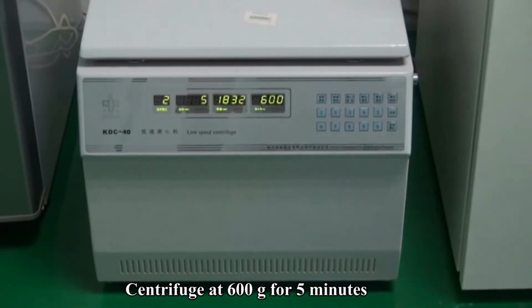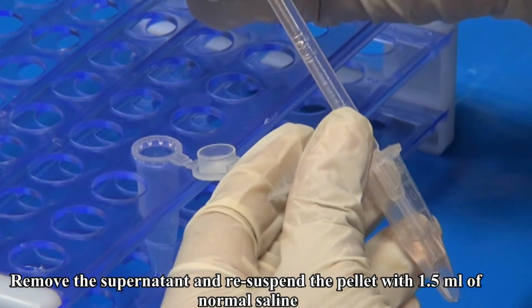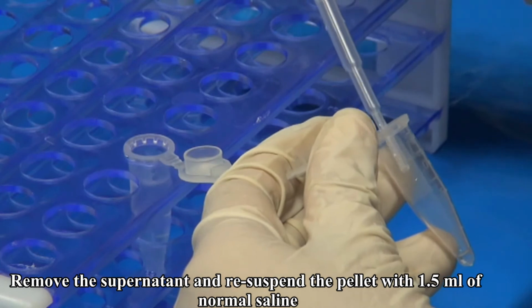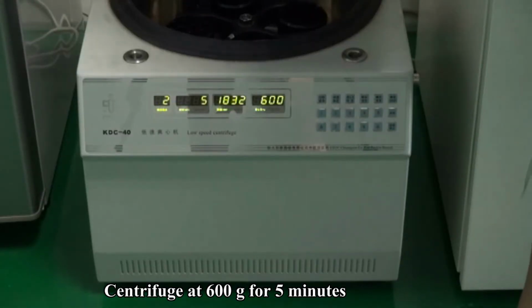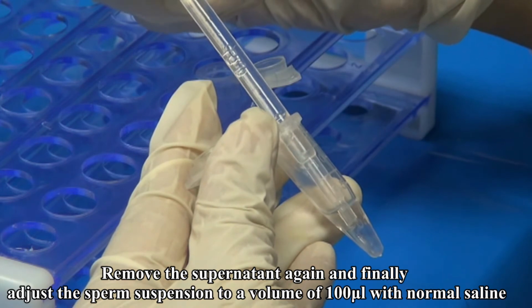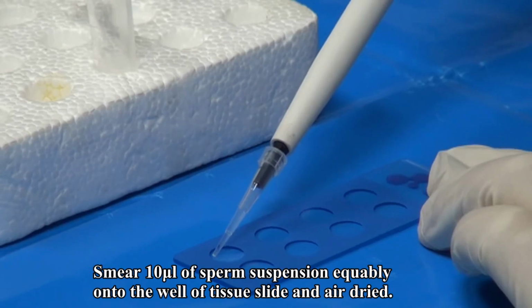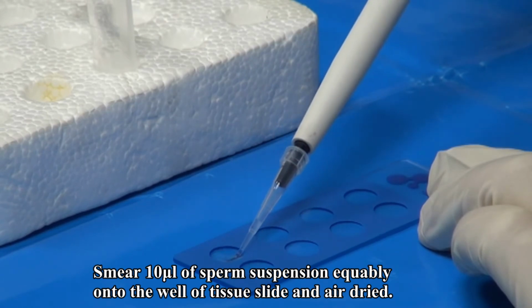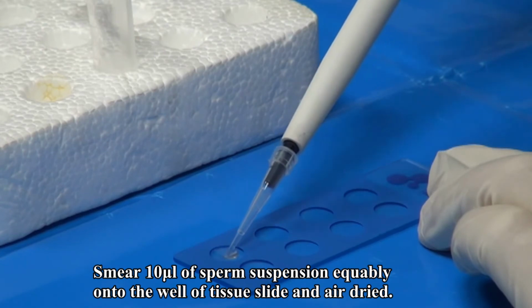Centrifuge the tubes at 600 grams for 5 minutes. Remove the supernatant and resuspend the pellet with 1.5 ml of normal saline. Centrifuge at 600 grams for 5 minutes. Remove the supernatant again and finally adjust the sperm suspension to a volume of 100 microliters with normal saline. Smear 10 microliters of sperm suspension equably onto the well of tissue slide and air dry.